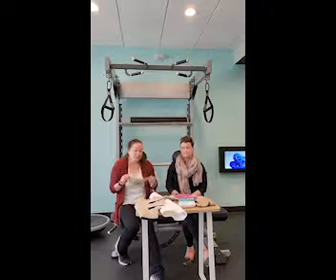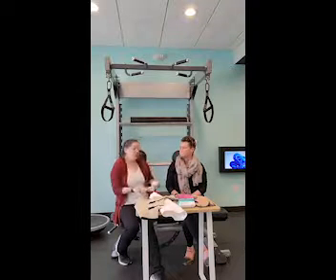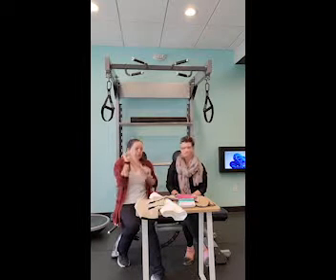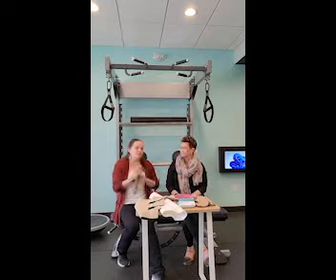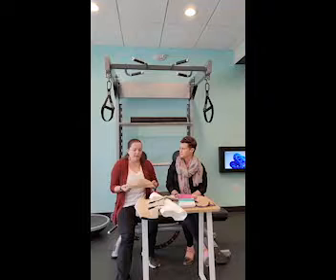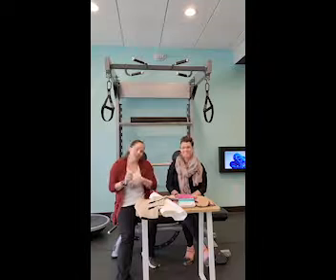So you don't have to hand wash them, you don't have to wait for them to dry sitting on your counter. In fact, you want to put them in the dryer to keep the compression in them. If you think about socks at the end of the day, how they're all stretched out, same thing happens to compression, is you need to put them in the dryer. Yes. I tell my patients, if you're traveling or stuff like that, hand washing's fine, but that dryer is probably the key piece. But it is nice when you can just throw them in the wash and not have to hand wash them.